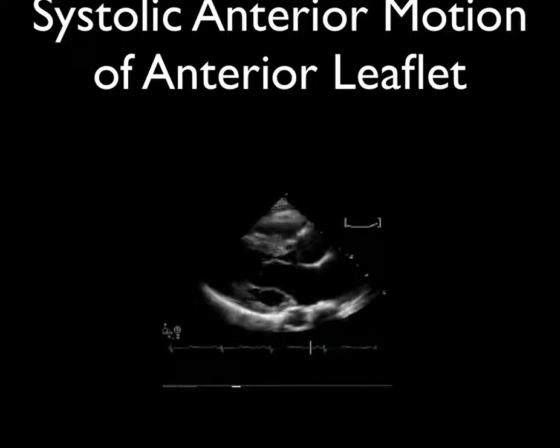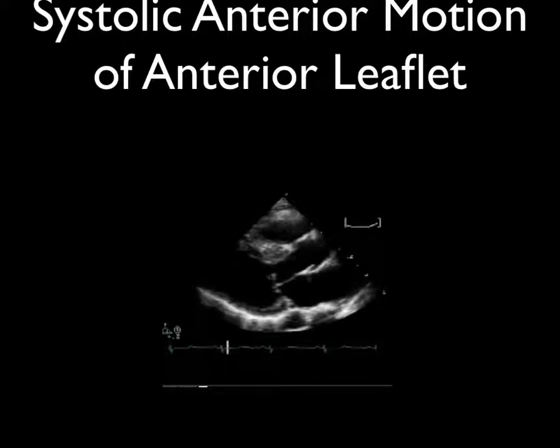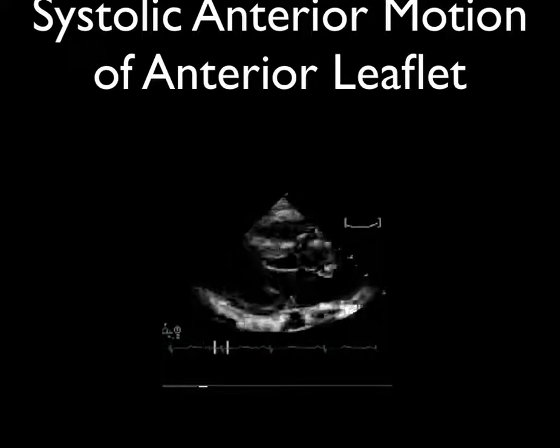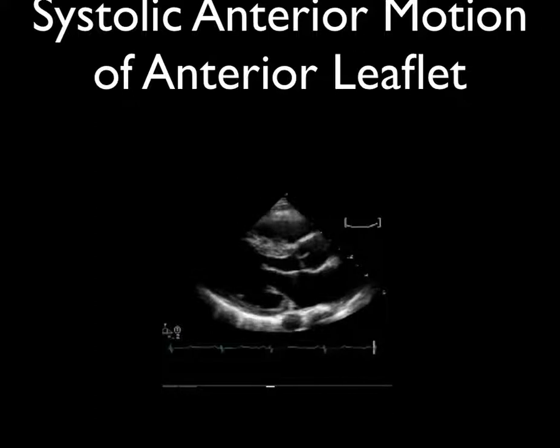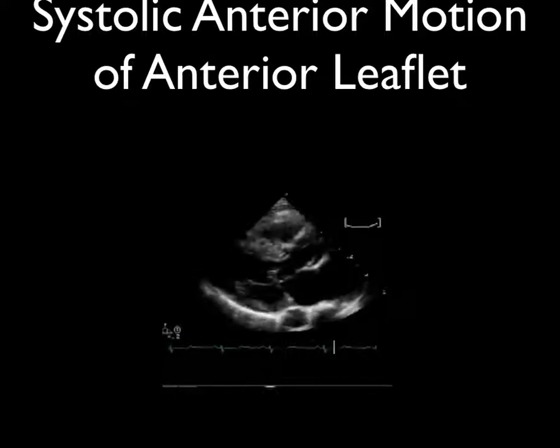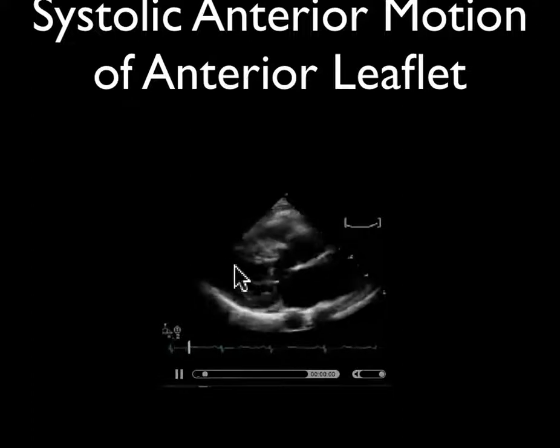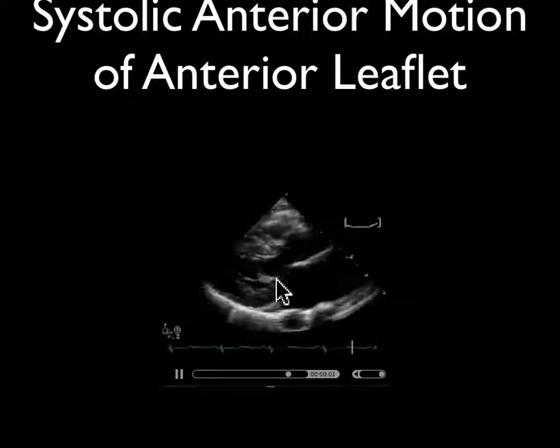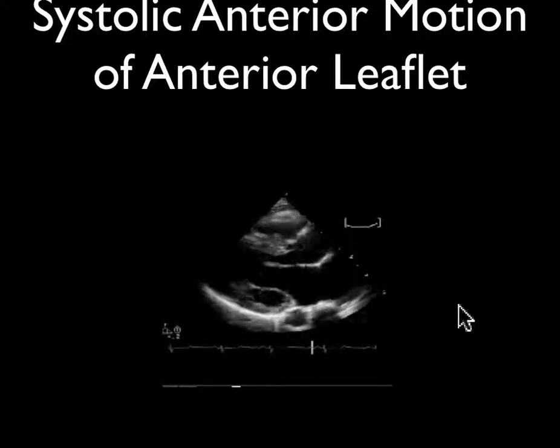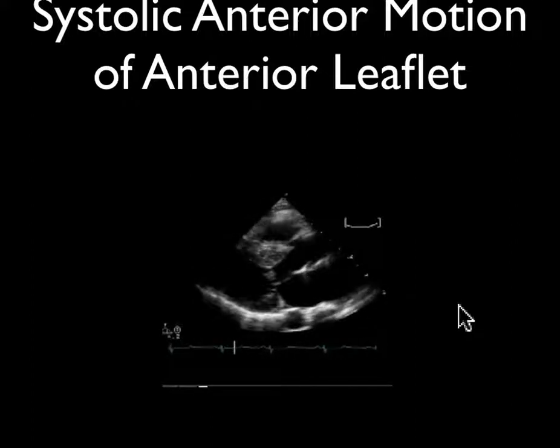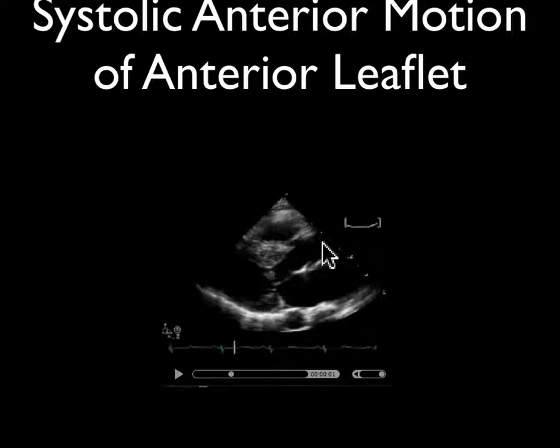Another finding is systolic anterior motion — you can get a systolic leaflet which further obstructs the outflow tract. Here is a cardiac ultrasound showing systolic anterior motion of the anterior leaflet of the mitral valve during systole. As the heart's squeezing, look what happens — that anterior leaflet flips up anteriorly and blocks the outflow tract. At end systole, this leaflet flips up and actually occludes the flow of blood trying to get out of the aorta. You can also see how thick this septum is.